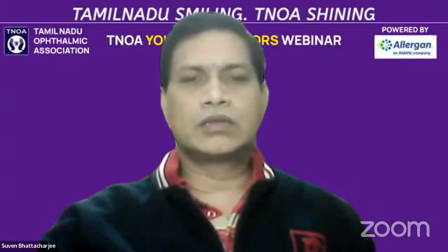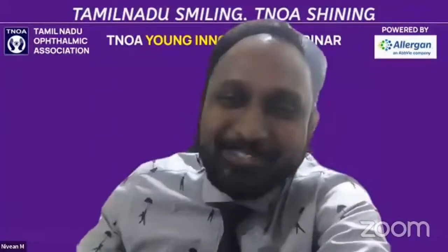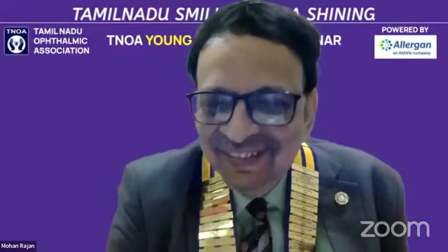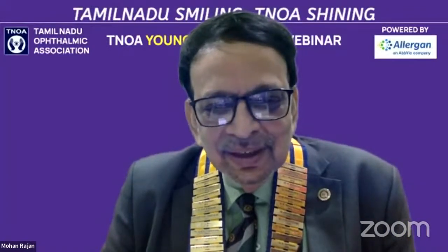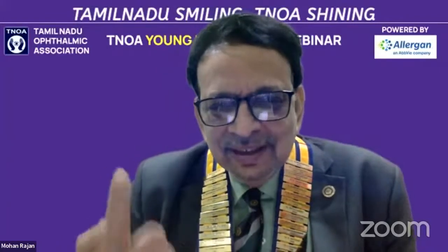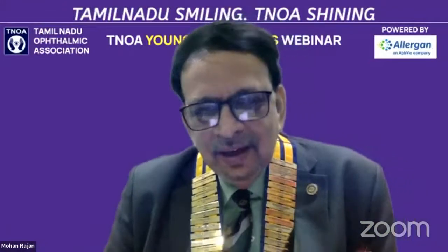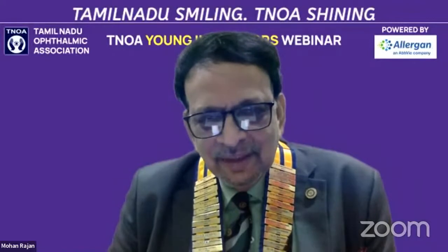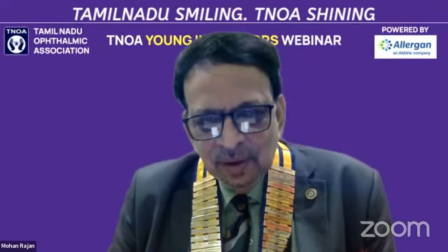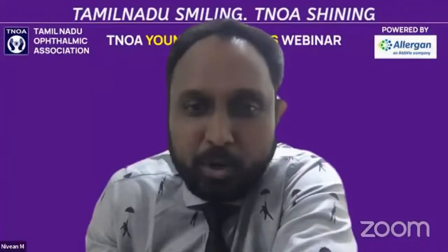Kumar, you had a lot of questions during our session. I know, sir. I didn't have answers that time. At the Gurgaon conference when we presented, we were on the dais together, and we were also concerned about the size of the sclerotomy, and also the haptic staying outside, whether there will be any erosion or something like that. So that is one concern which we had. So till now we have not had any case of. No, sir, no exposure. So we slowly moved on to the groove actually.